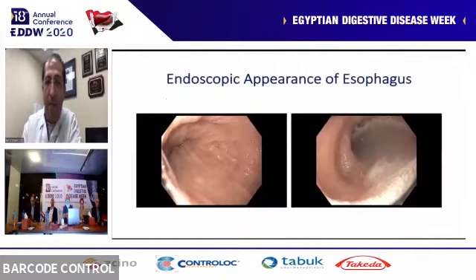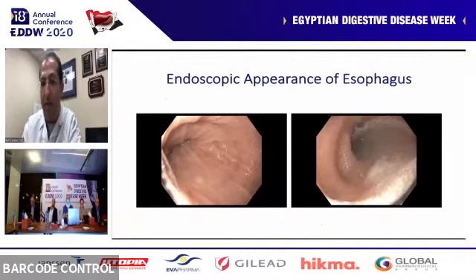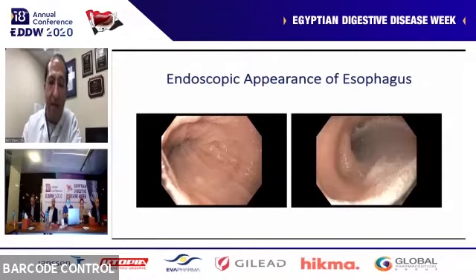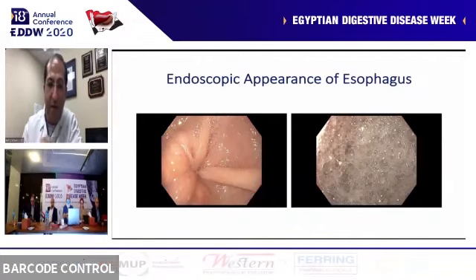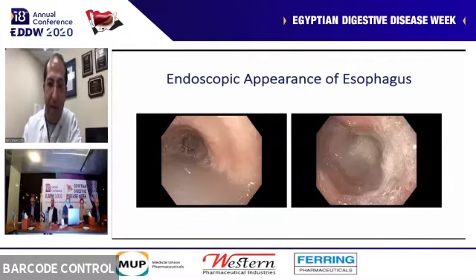So these esophaguses are challenging. They're twisted. Some of them can be sigmoid esophagus. Some of them can be as dilated as a stomach, as in the picture to the left. They have that characteristic appearance of a very tight sphincter. You see a lot of frothy saliva. Sometimes we see candida esophagitis, where the liquid pools.